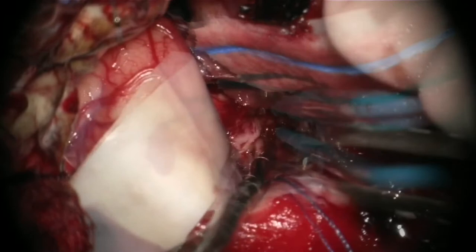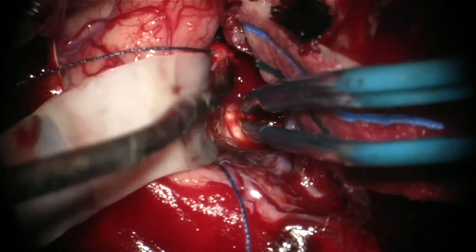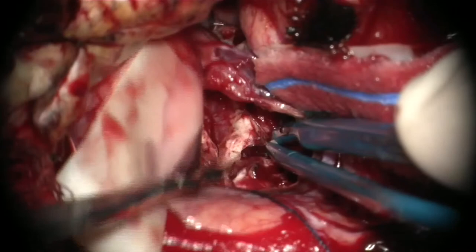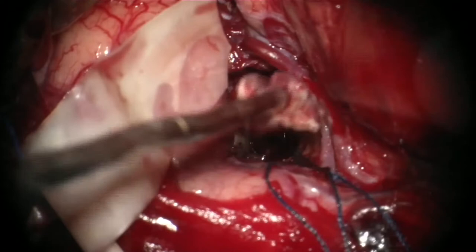I just open into the ventricle — that's the temporal horn. I'm trying to find the uncus recess anteriorly and the choroidal fissure posteriorly. That way I can do my posterior disconnection of the hippocampal head. And now I can work laterally to do the lateral disconnection at the level of the collateral eminence. Medially I can find the arachnoid with the tributaries of the basal vein of Rosenthal. And I'm now doing my medial disconnection.